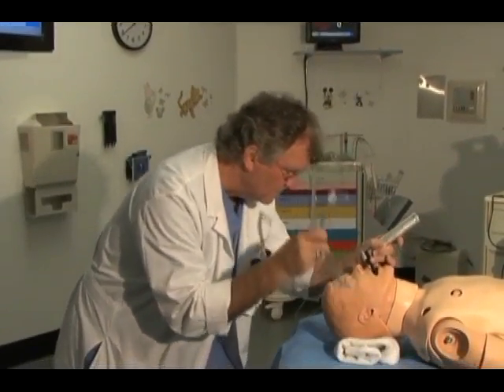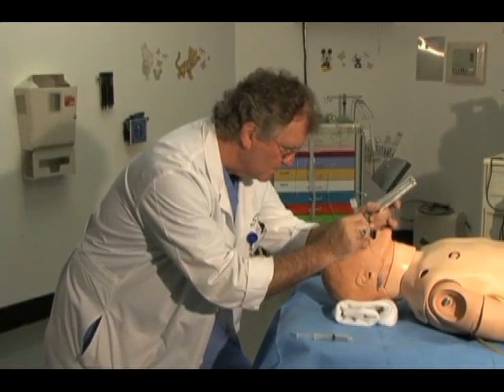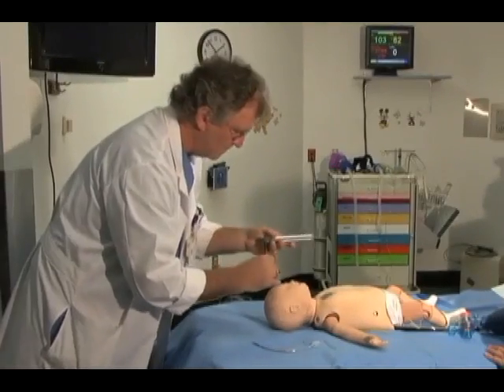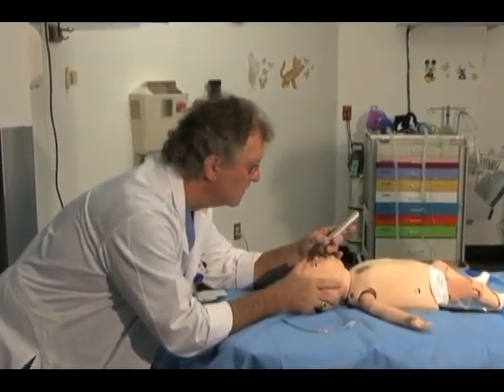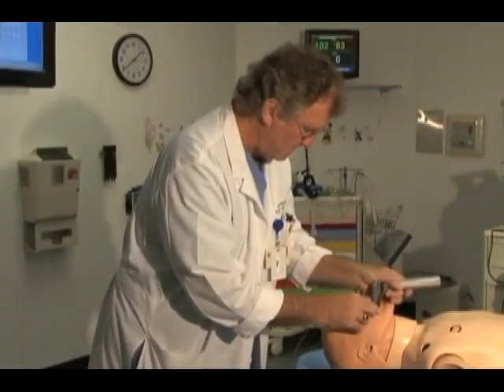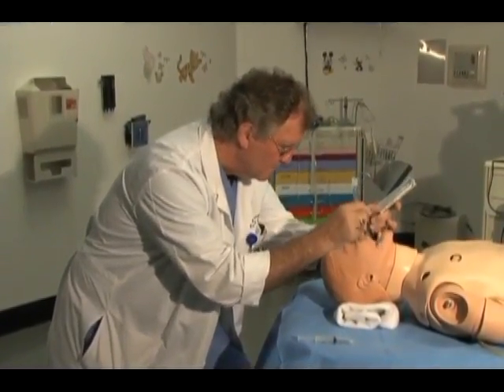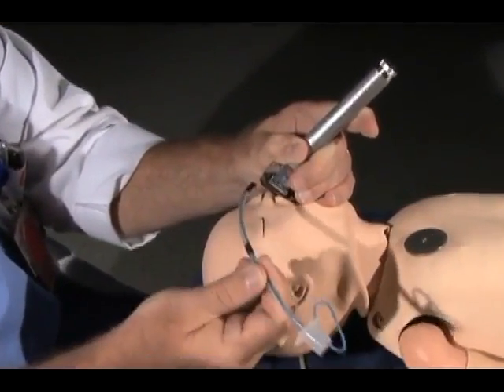This is not a problem in the adult, as there is plenty of mouth opening space to visualize the tube passing through the glottic opening. In the pediatric patient, the amount of oral space for inserting the tube is limited. As such, placing the tube straight into the trachea as was done in the adult procedure causes loss of ability to see the tube entering the glottic opening.